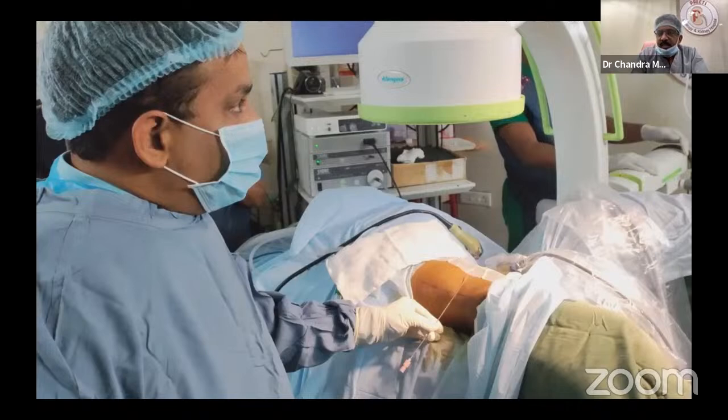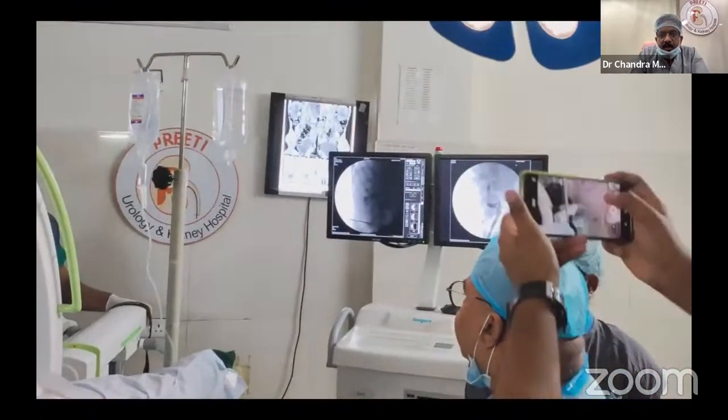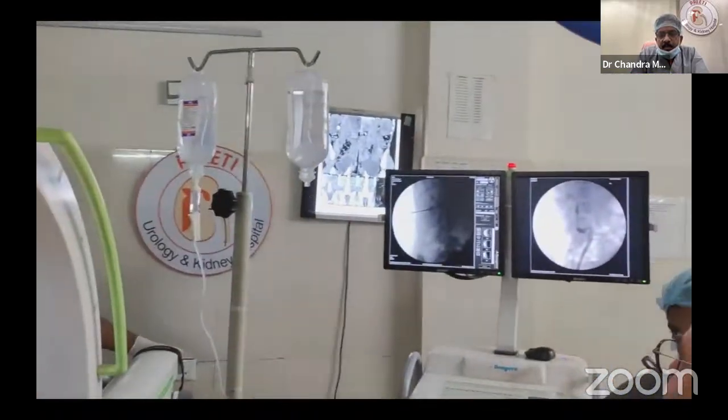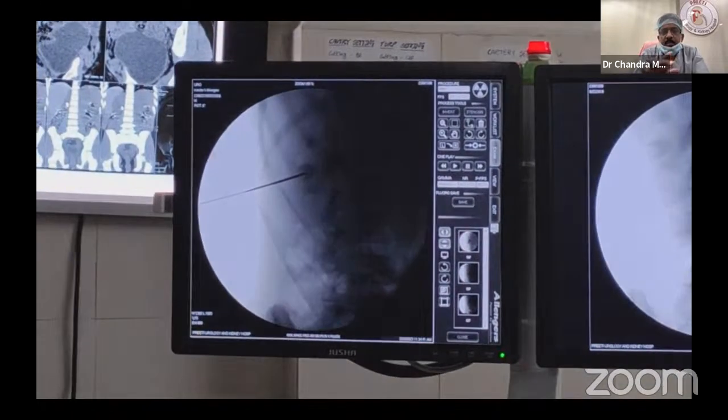That is the first worry, no need to worry. Like in prone PCNL, you put the needle in the direction of the calyx, that's all. Let any rib come, let any position come, no problem. First step, in 0 degree, you put the needle in the direction of the calyx. Let us see here. See, there it is quite below, so automatically you have to go up like this. Now it is seen. This cup is seen. This cup I am aiming. Middle calyx is safe in supine PCNL.